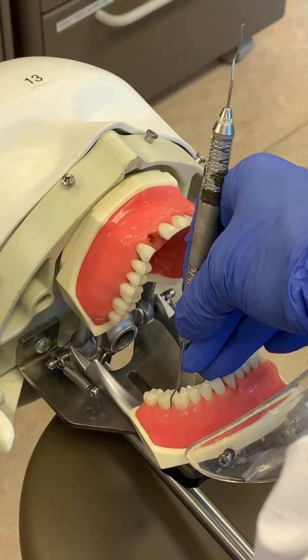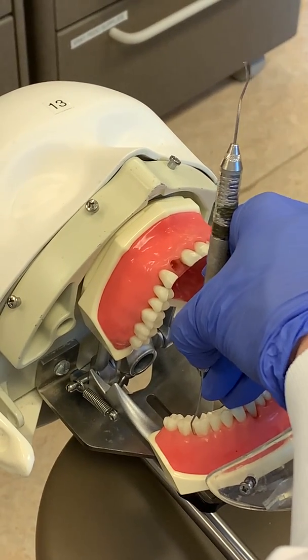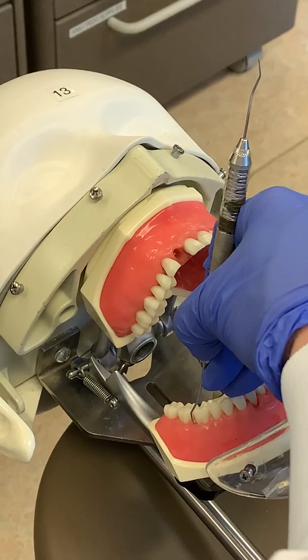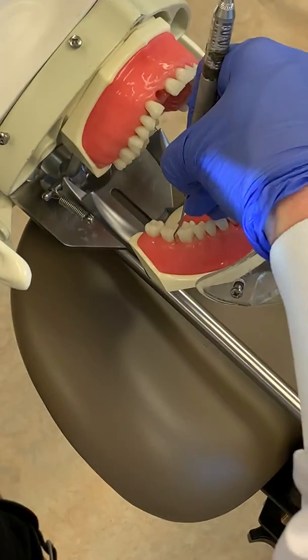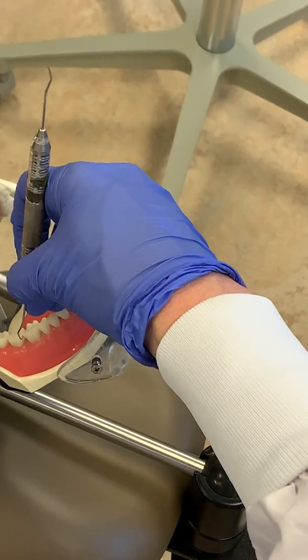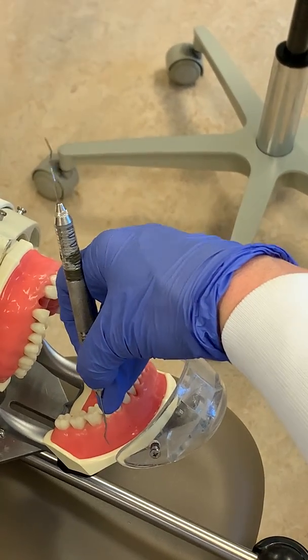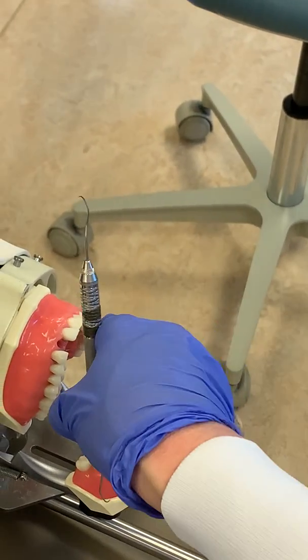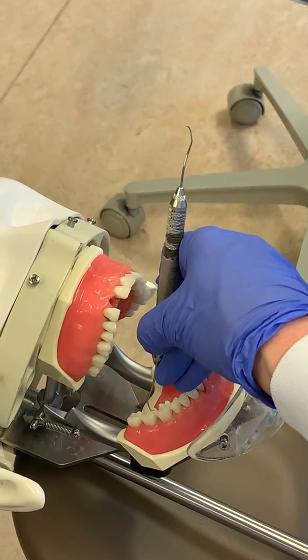Get that tip right on the line angle and keep the last one to two millimeters of the tip on the tooth. As you go into the interproximal, make a rocking stroke to feel the surface. As you do this, you have to turn your fulcrum — we call it pivoting. Pivoting means you're driving with your fulcrum by turning around on your fulcrum finger, keeping that tip on the tooth the whole time as you walk from the line angle to the contact area.